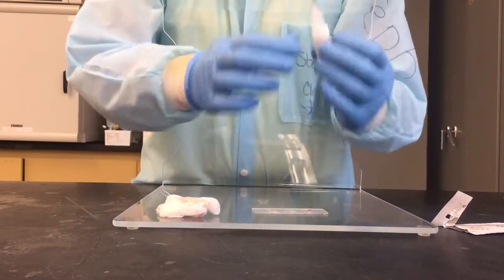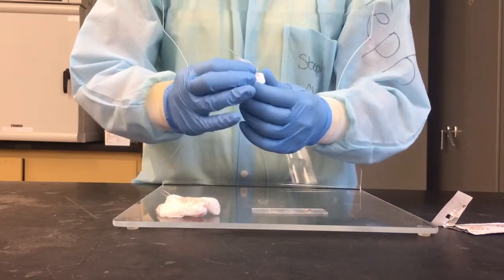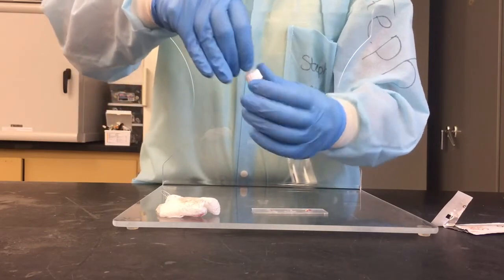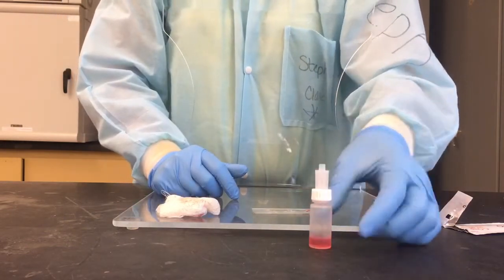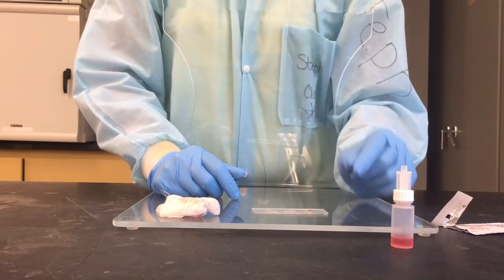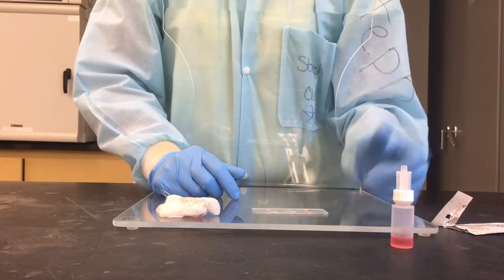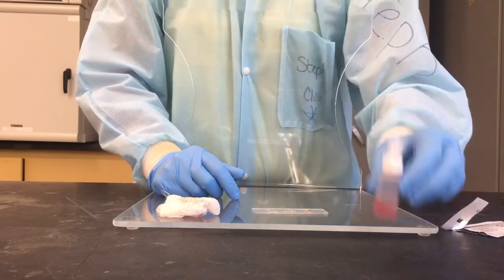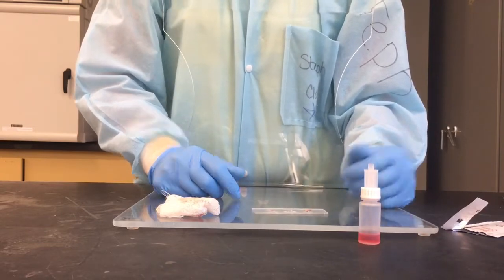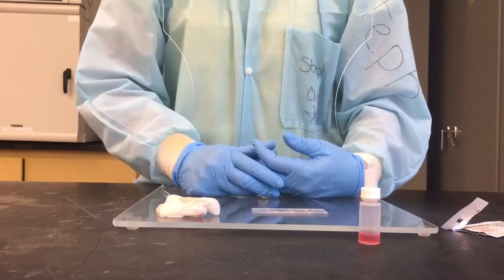Once you've loaded your hemocytometer, take the top back out again, turn it around so it's back the way it was, and then stick it back on the rocker. Do not throw out your specimen, because if there's something wrong with your count and you need to go back and redo it, you don't want to have to go through the whole process of setting this up again before you're able to start counting your specimen.